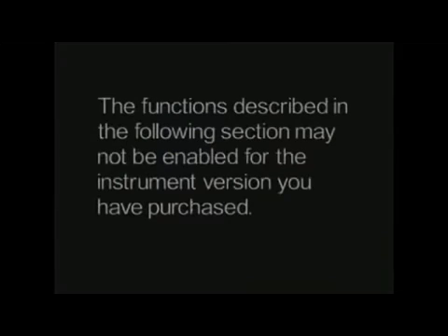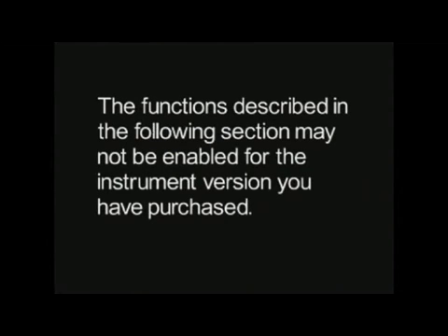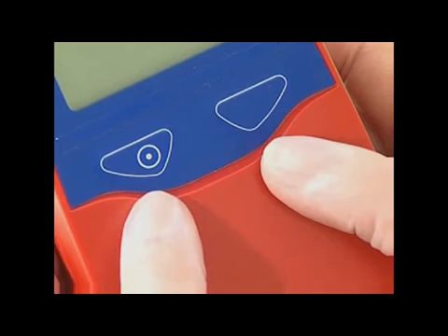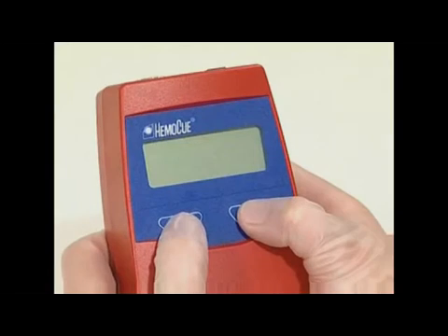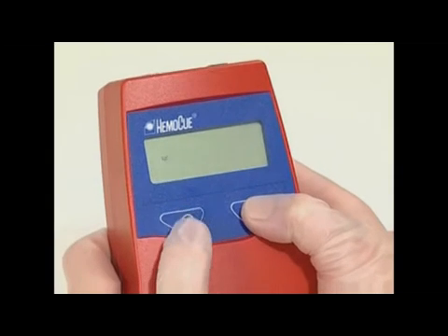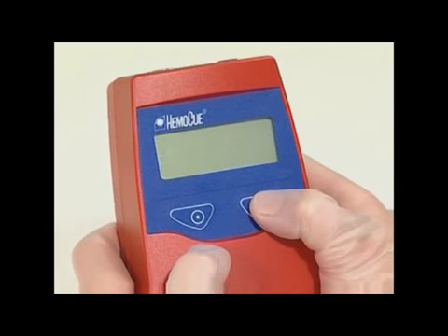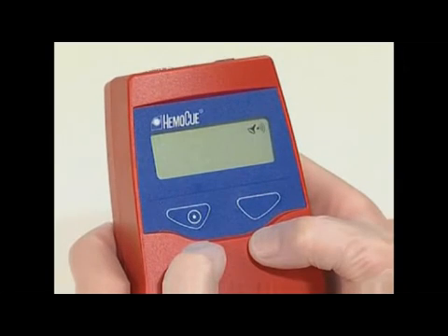The functions described in the following section may not be enabled for the instrument version you have purchased. For further information, contact your Hemacue distributor. Press both buttons at the same time — the display now shows a flashing QC symbol. Use the right button to scroll until the display shows an audio symbol in the upper right-hand corner.